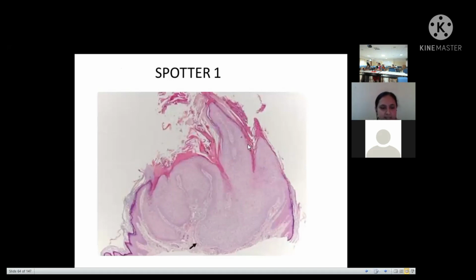So this is the next spotter. Anybody, what do you feel it is? Good morning, ma'am. I am Dr. Aparna, second year postgraduate in SSIMSRC.